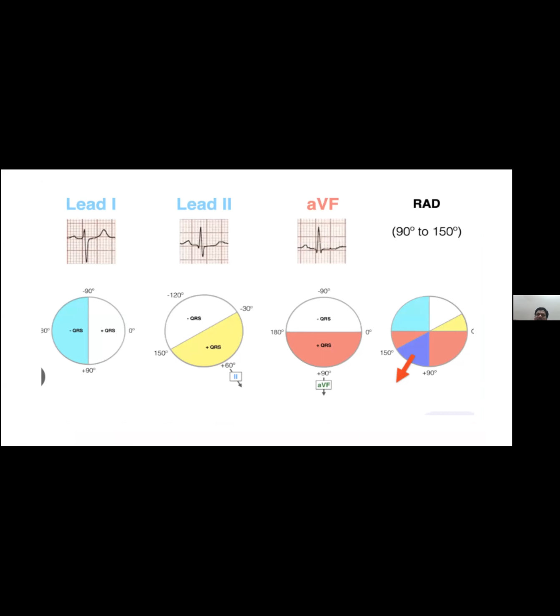See, everybody keeps changing whether the patient is in sinus rhythm or not. P wave upright in lead 1 and inverted in AVR, simple, it is in sinus rhythm. PP is constant and fixed, and every time the P wave comes at the expected time. And whenever there is the tallest complex in lead 2, then it means the patient is in sinus rhythm. Lead 1 negative, lead 2 and AVF positive, the patient has a right axis deviation.